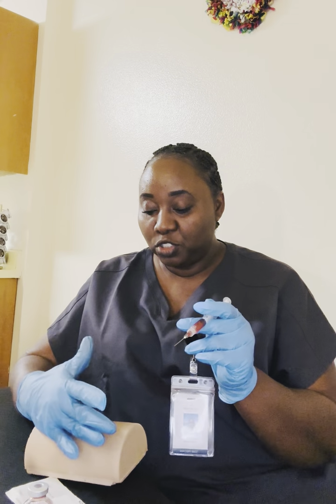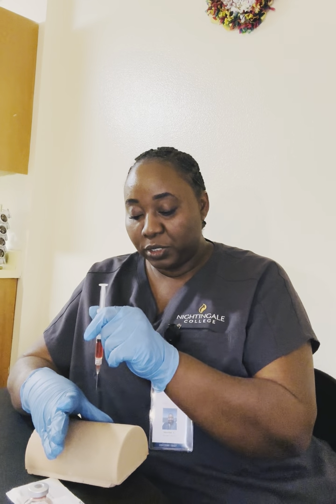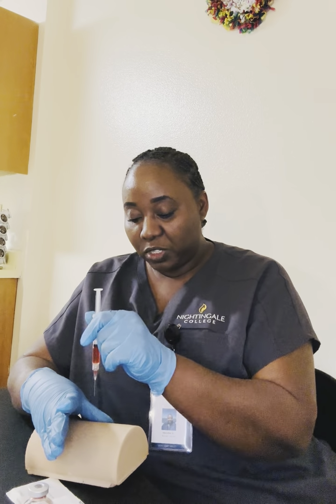Remove the cap, and then like I said, use the ulnar side of my non-dominant hand to push the skin down tight, and with the other hand, I'm going to push in the injection. It's going to be at 90 degrees. I'm going to go straight ahead and inject the patient straight up at 90 degrees.